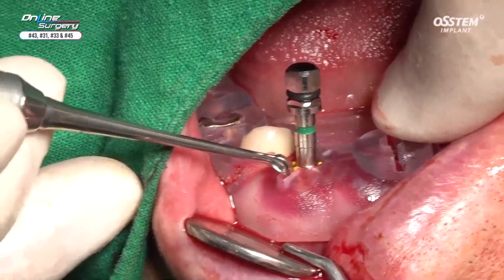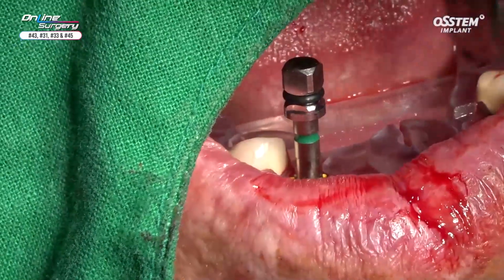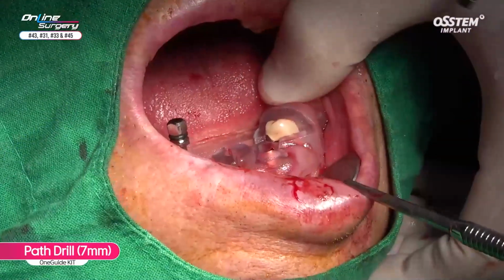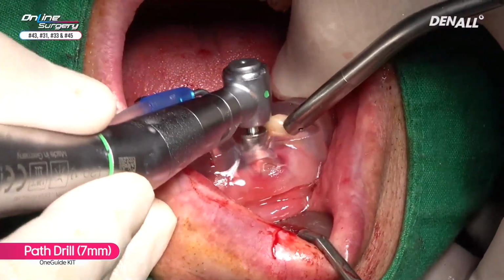This is adjusted up to the yellow. The depth and path is adjusted. So I'm going to put this in and then move on to the next side. In order to prevent slipping, I'm going to start with K9. If you utilize this in the place where implant is placed, it's better.